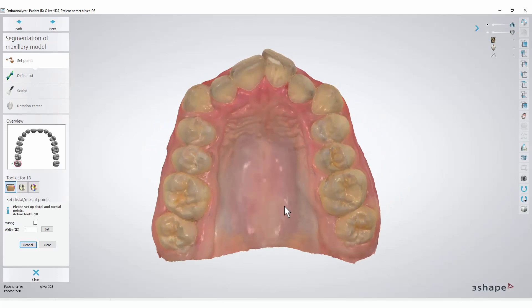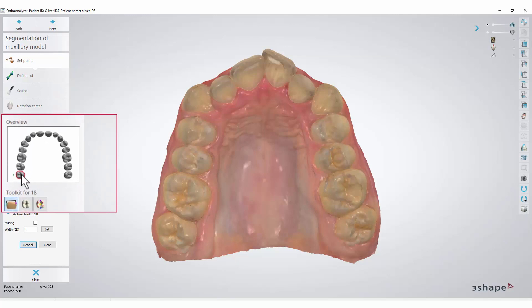Before you start, it is important to inform the software which teeth are missing. If you wish only to segment some of them, you should also select the teeth that you wish not to segment as Missing. Right-click the chosen tooth and select Missing.